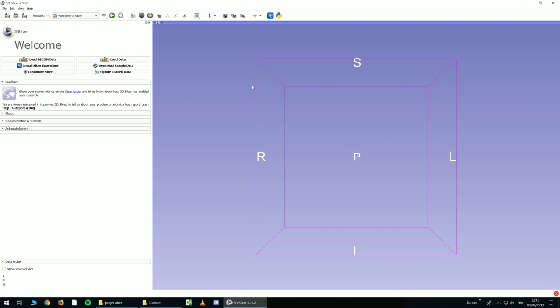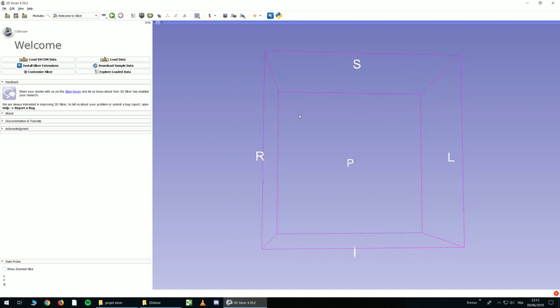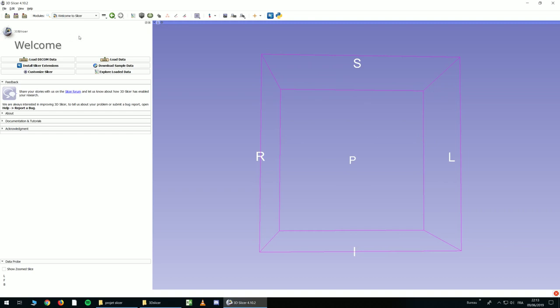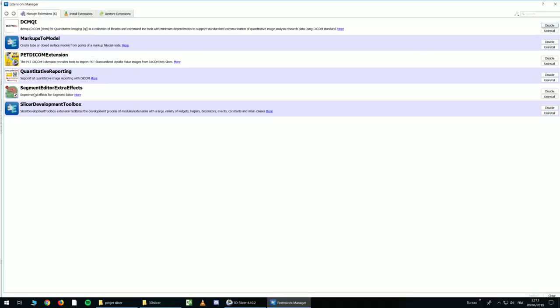Once the app is started, you will probably get something like this. To use Slicer, you first have to install useful extensions. So you go in View, Extension Manager, and I recommend you to use this one.